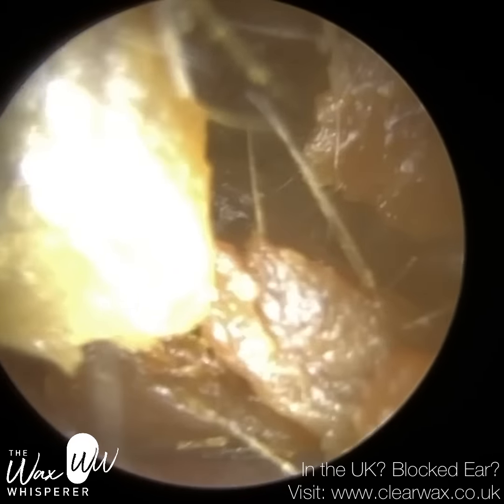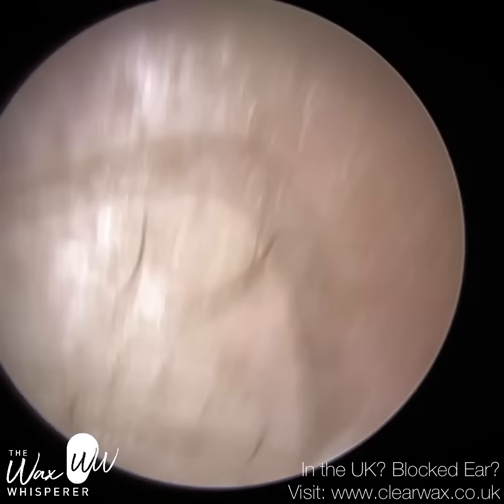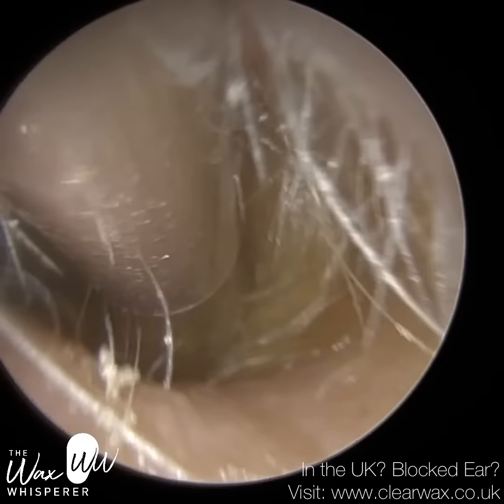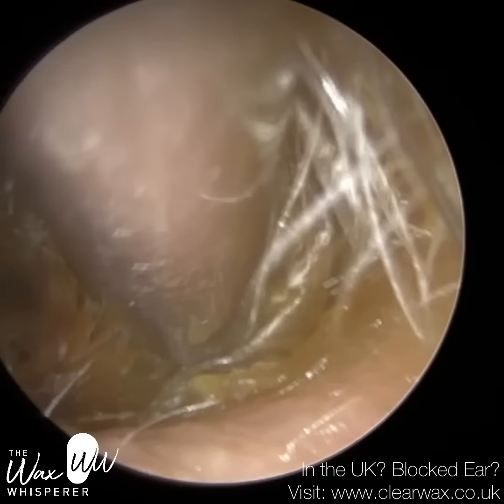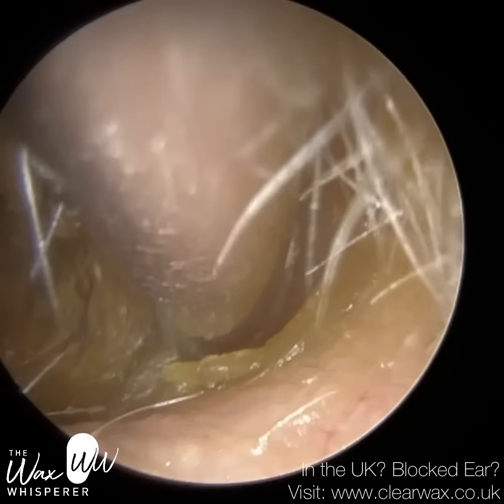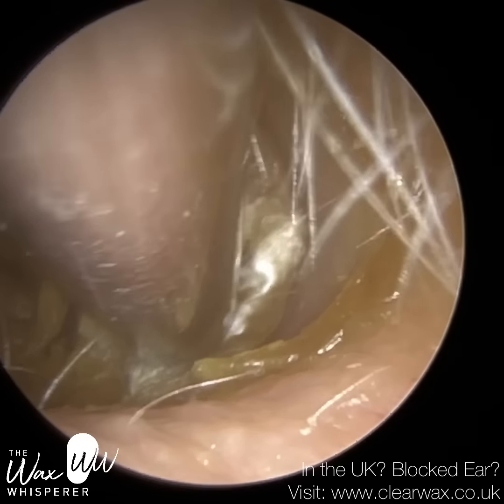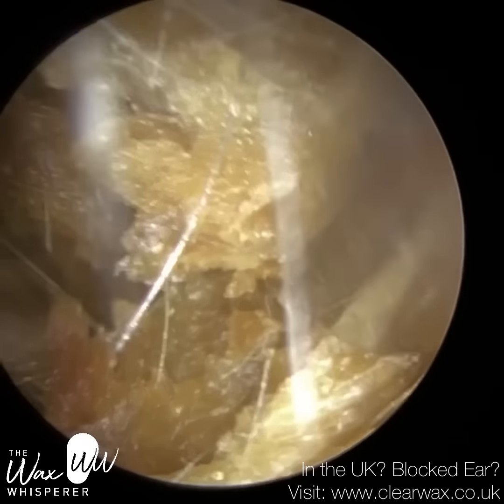I have a patient here who attended with bilateral blocked earwax and also a lot of dry crusted skin, and we're just commencing with their left ear, which is the worst one out of the two. So I'm just using the standard Zollner suction probe to perform microsuction, and I'm just trying to elevate this crusted skin off the base of the ear canal. You can see it's really dry, very glossy.